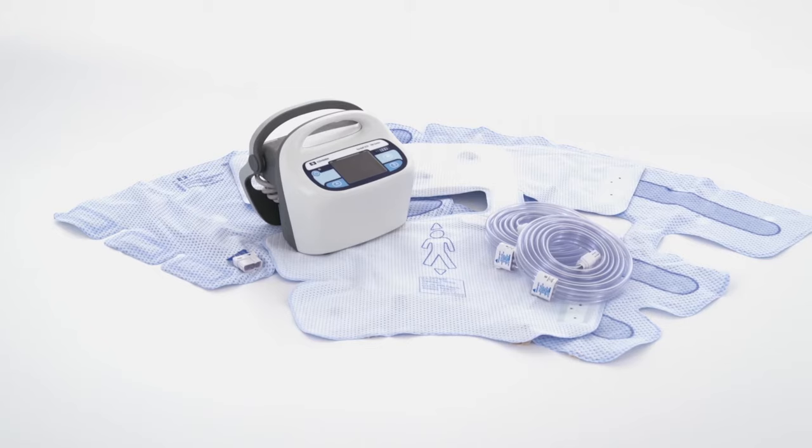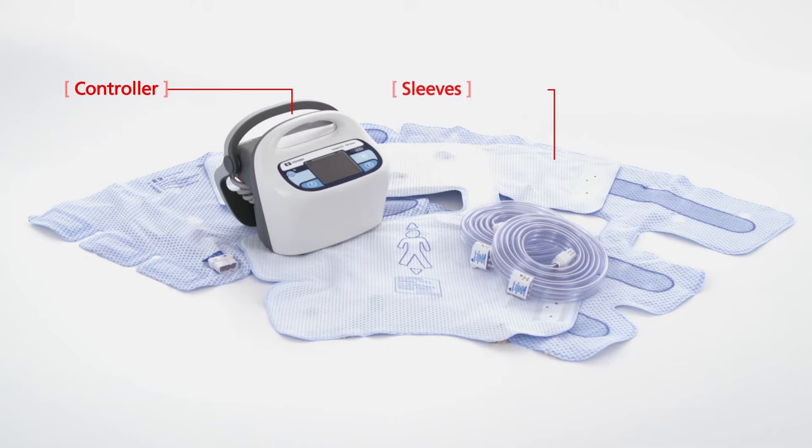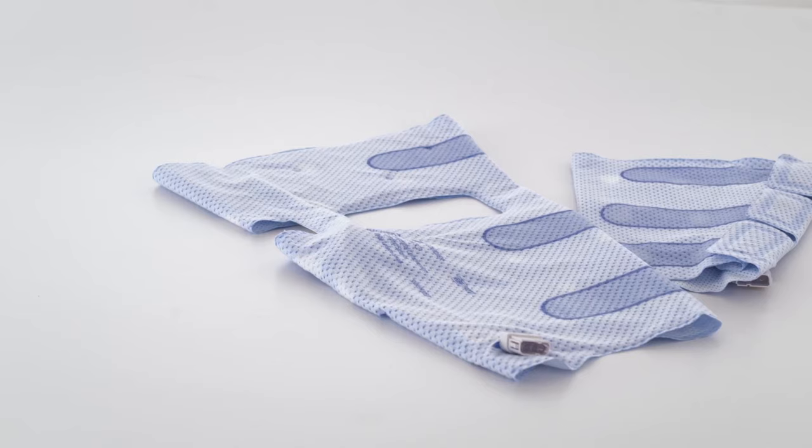The Kendall SCD system is composed of three separate components: a controller, sleeves, and tubing that is used to connect the controller and the sleeves.